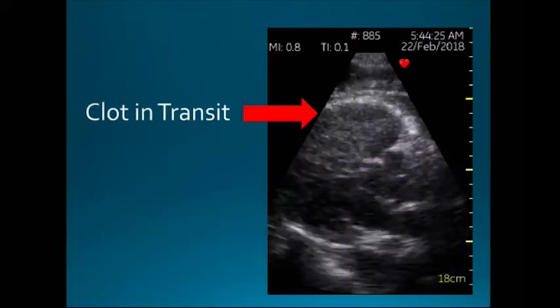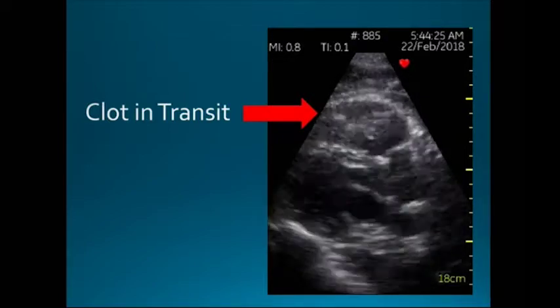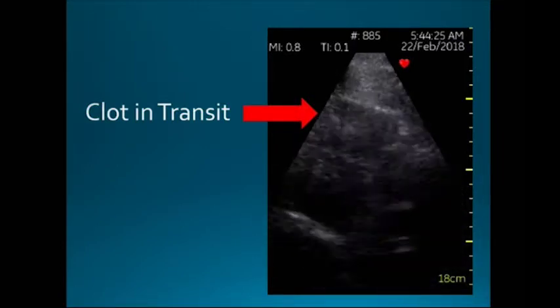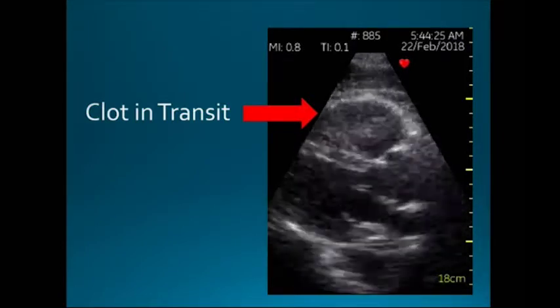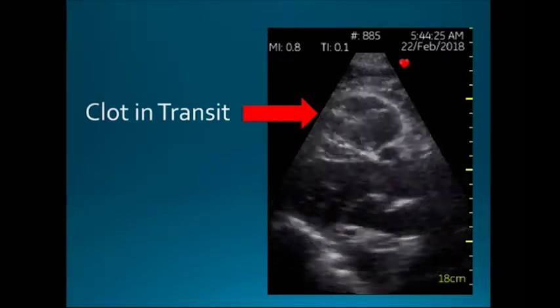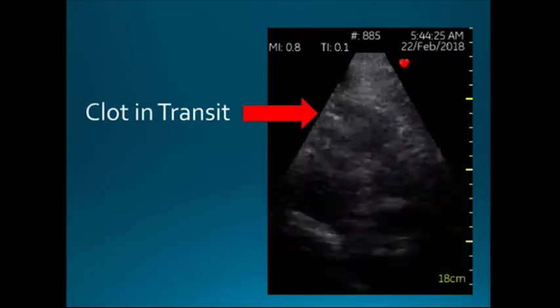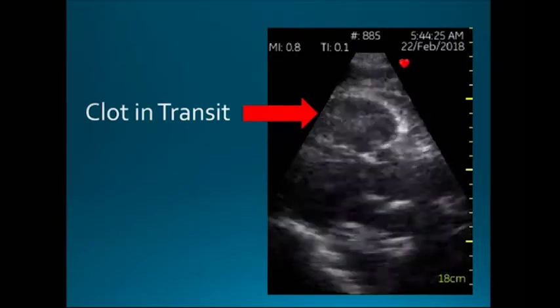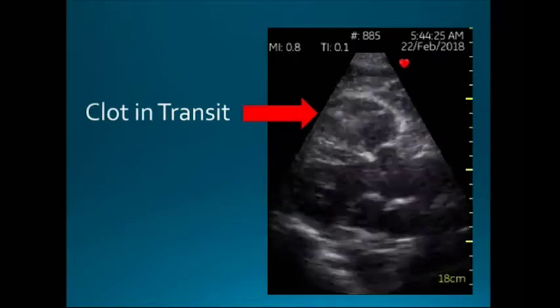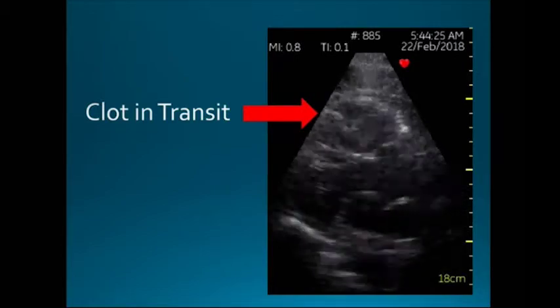He took a look at this guy's lungs and found that, again, the profound hypoxemia didn't correspond with the amount of B lines he was seeing. So he looked at his heart, and you can actually see right there. Do you guys see that thing bouncing around, kind of like popcorn kernels and stuff? That's clot banging around in his right ventricle. That's a PE in progress. He urgently got this guy transferred to a place that did interventional radiology. They did a thrombectomy, a non-invasive thrombectomy, and probably saved this guy's life.